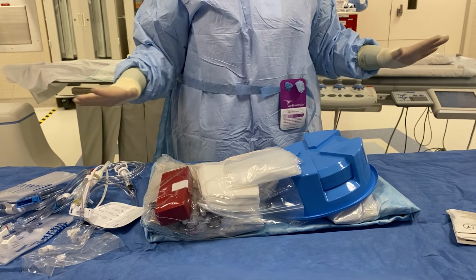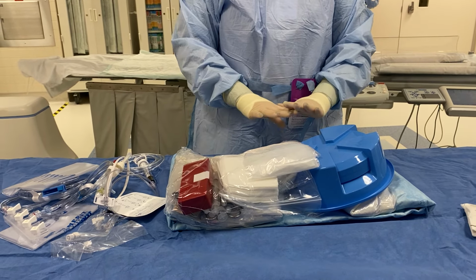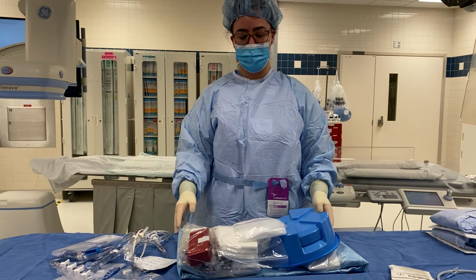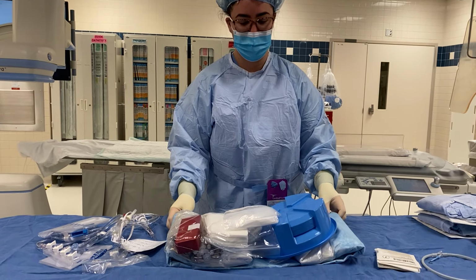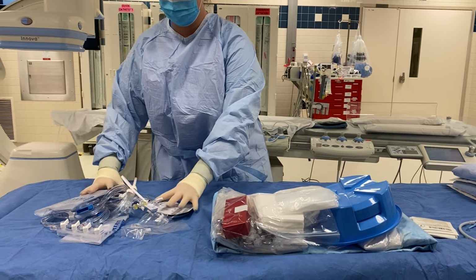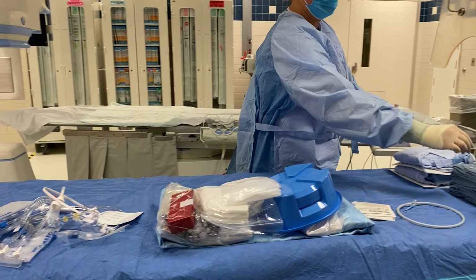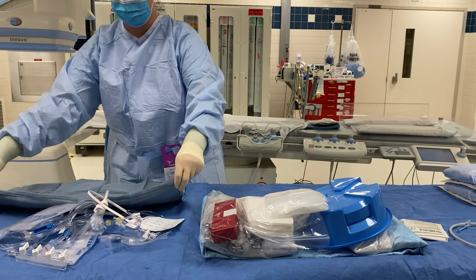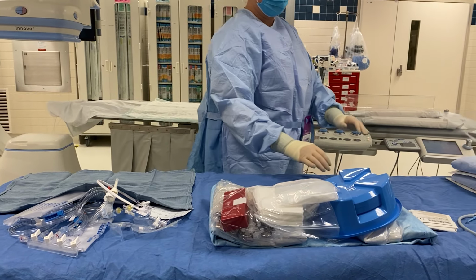Now the next thing we want to do is have a nice clean surface with towels, which is going to help us keep our table dry during the procedure. I'm just going to move this out of the way, push everything to the top, and I'll grab my towels and lay one single layer across the length of my table.